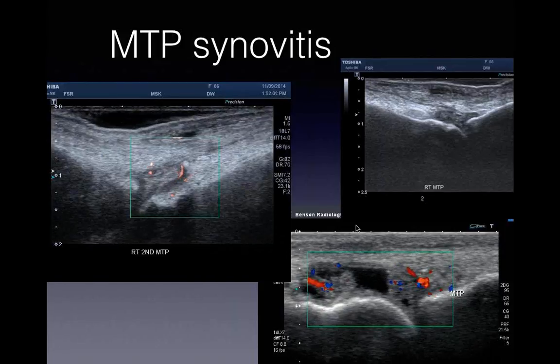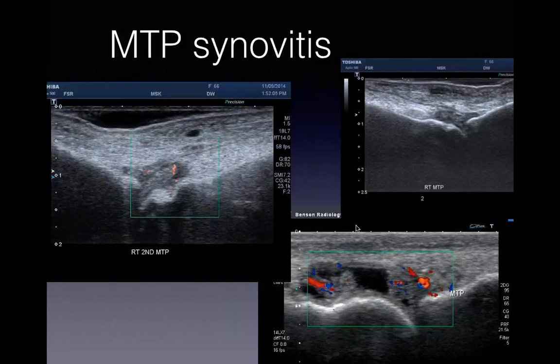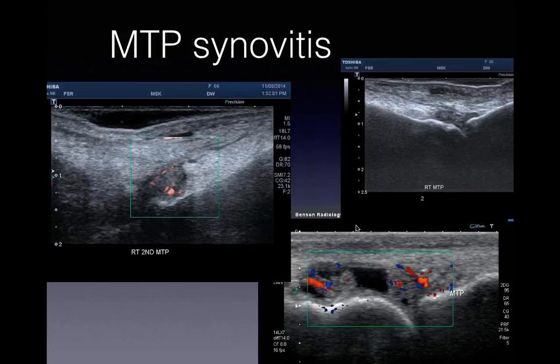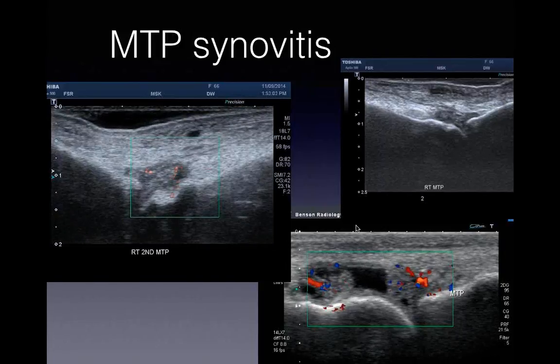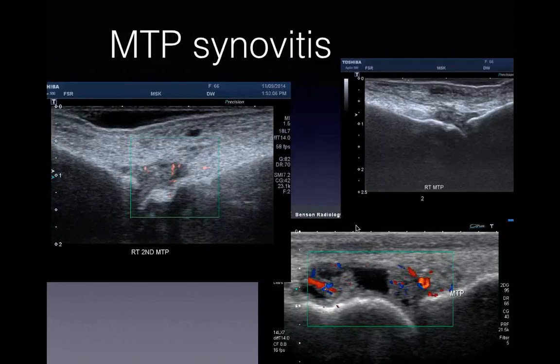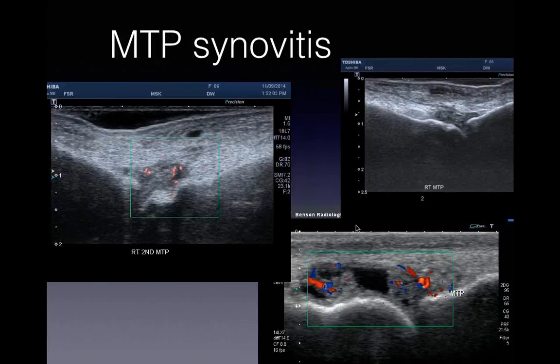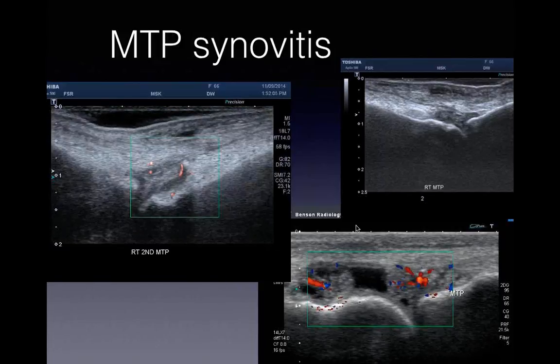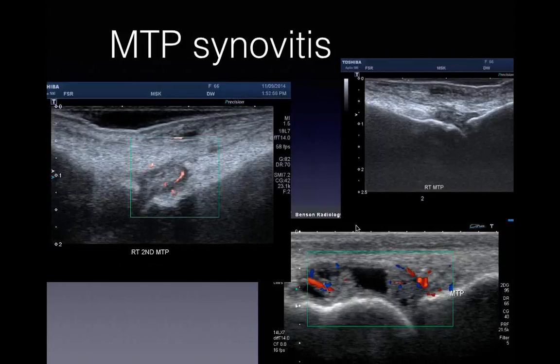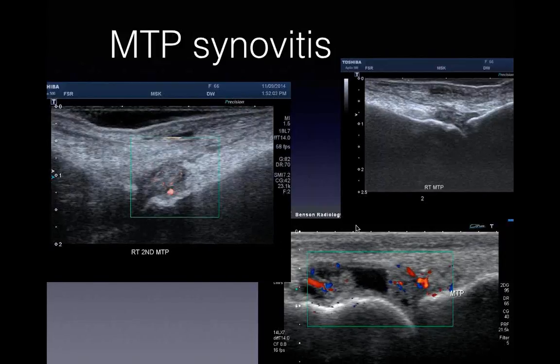The tip is to use a really light touch, especially when using a color Doppler assessment. If you can relax that foot with lots of gel, a gel standoff, take their foot out of a weight-bearing environment - and using SMI if you've got it, you'll see that neovascularity. You'll see that active inflammation with synovial proliferation of the joint. You'll see it a lot if you look for it.